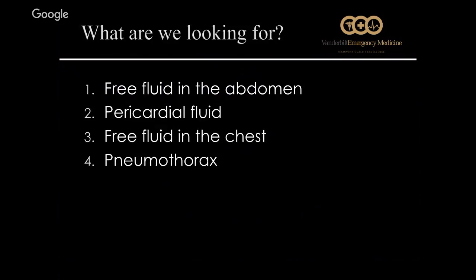So what I'm teaching today is point-of-care ultrasound. So we're not talking about doing a completely comprehensive ultrasound of everything in the abdomen. When I'm talking about point-of-care ultrasound, I'm talking about a very focused ultrasound exam where I approach the patient with a very specific clinical question. So the way I compare this is, a comprehensive ultrasound would be like opening up a newspaper and just seeing what all kind of news happened throughout the world yesterday, as opposed to point-of-care ultrasound. I'm going to go to Google and ask a very specific question. Did the Cubs win last night?